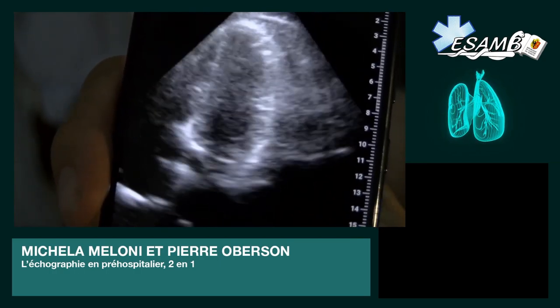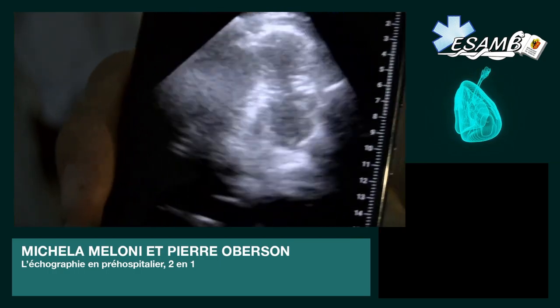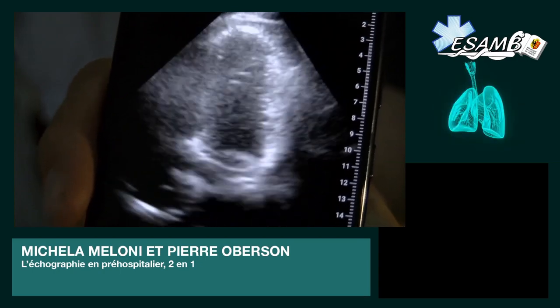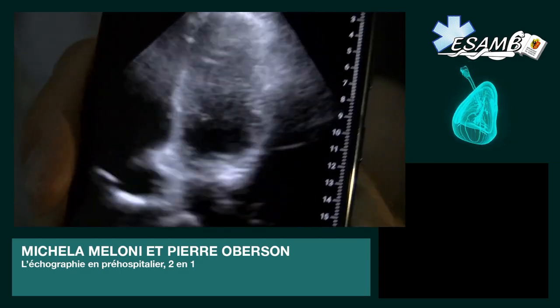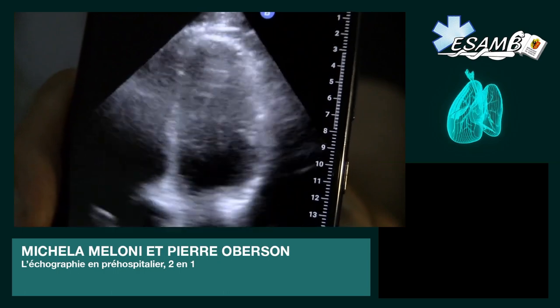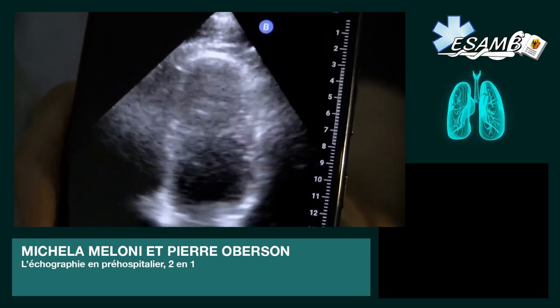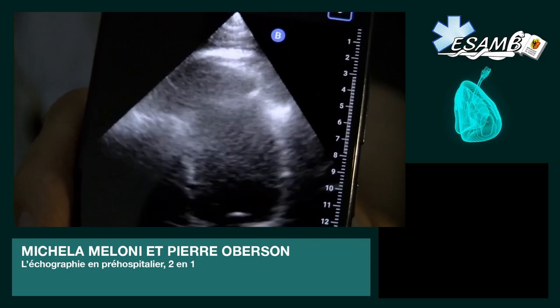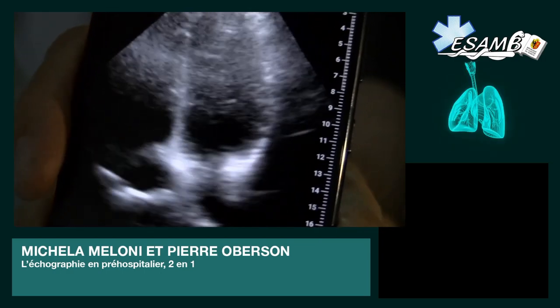Pour ceux qui sont en live, vous allez pouvoir voir le cœur de Luc. On voit en tout cas bien le ventricule gauche, et un petit peu en dessous les oreillettes et les valves qui s'ouvrent et qui se ferment.